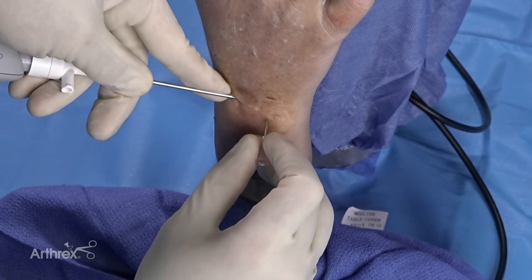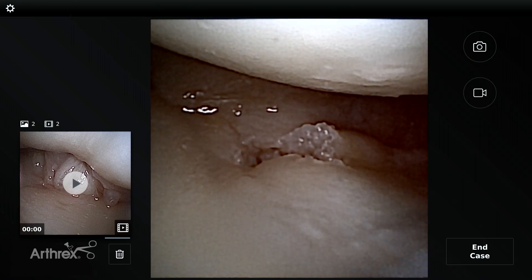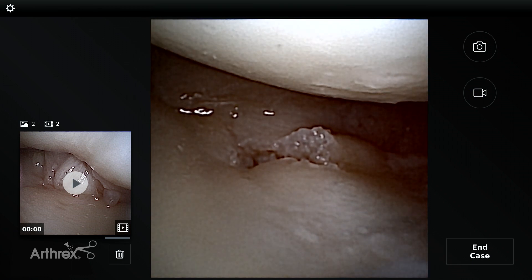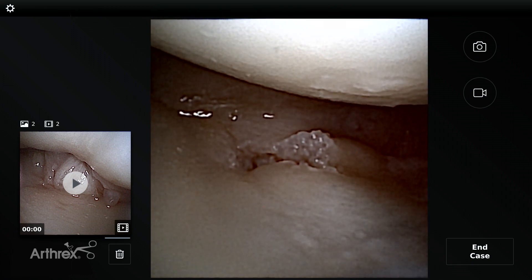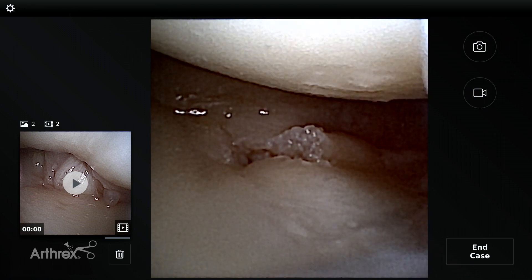So now we're doing DRUJ arthroscopy. Many of you are saying: how am I going to get into that joint? It's a tiny joint and it's hard to see inside there. A little trick we can do with the nanoscope is I'm actually in the 3-4 radiocarpal portal looking over at the TFCC.